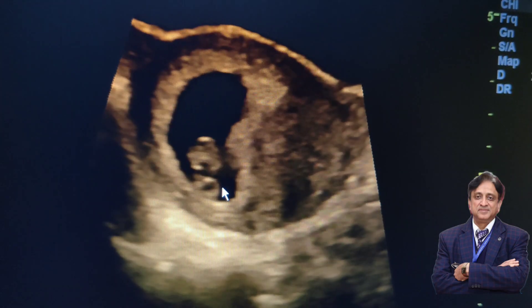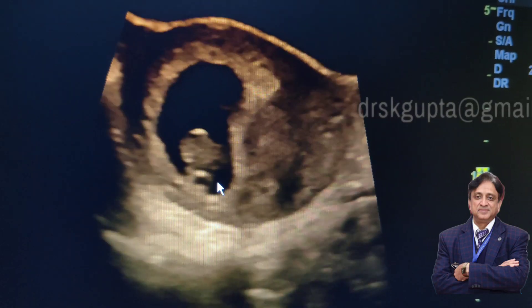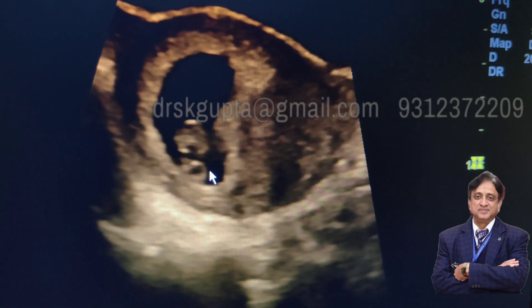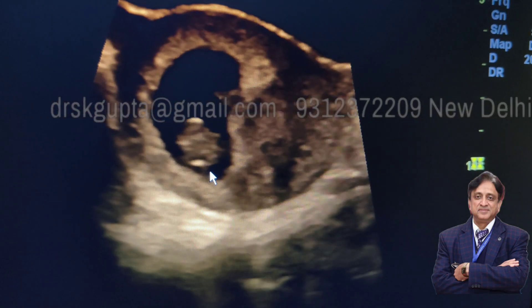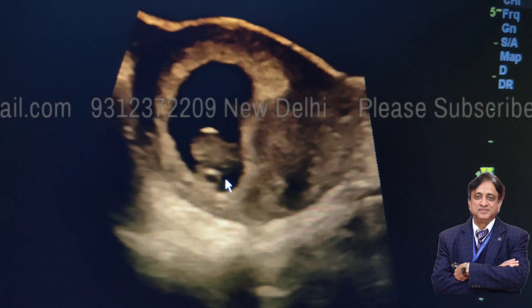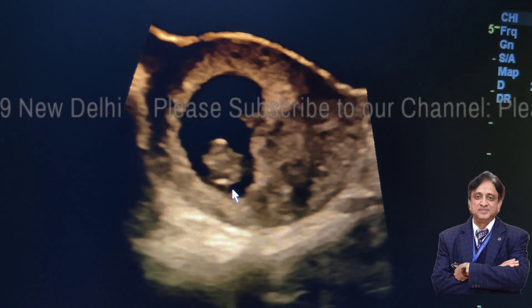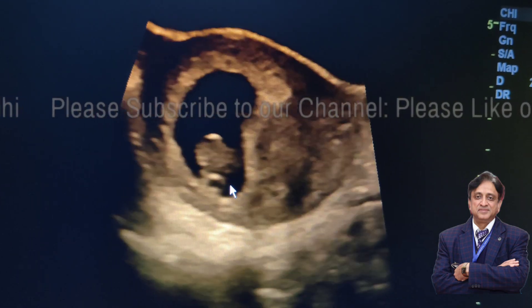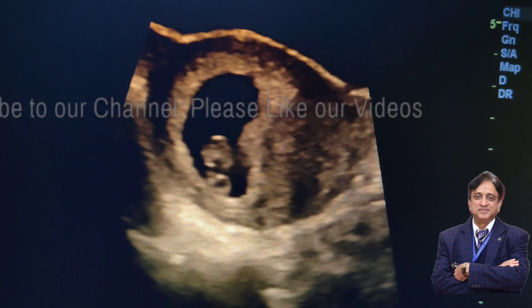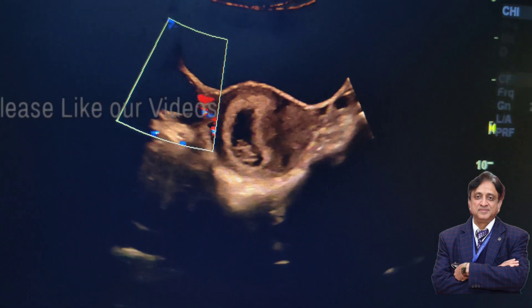You should not forget to look for another sac, because sometimes having seen one sac might mislead you and there might be another small sac in the uterus giving rise to a twin pregnancy. But here in this patient we found that there was only one sac.